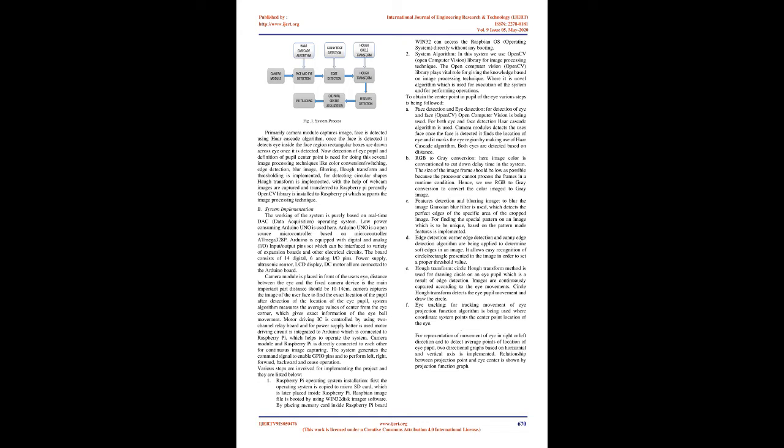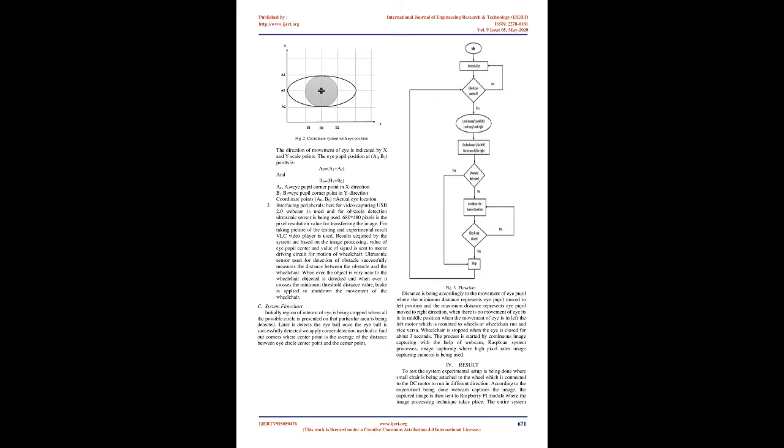The fuzzy logic controller divides into two categories where the wheelchair movement is controlled based on the degree of rotation of eye movement. This is done by a fuzzy classifier, FC. The motion of the wheelchair is controlled by a fuzzy proportional derivative, FPD, which controls the angular speed of the motor for linear and steering motion.